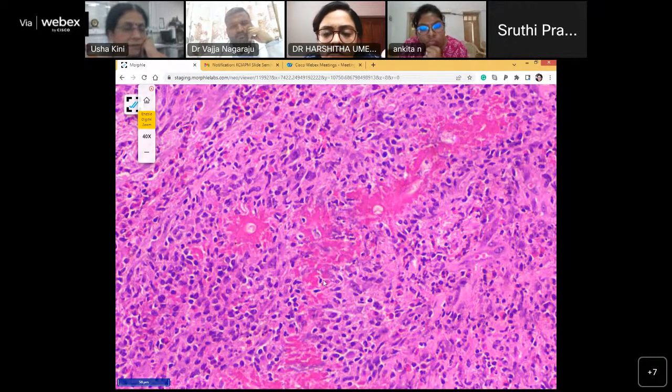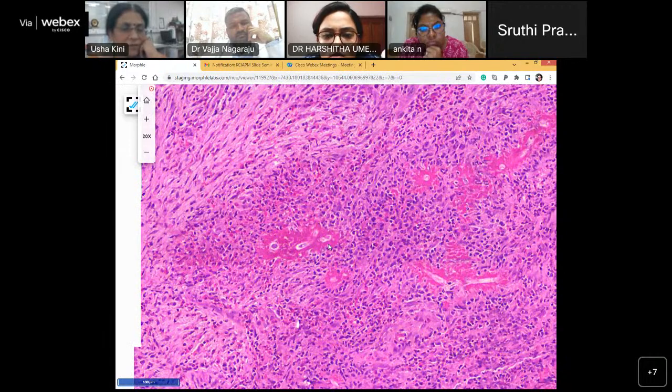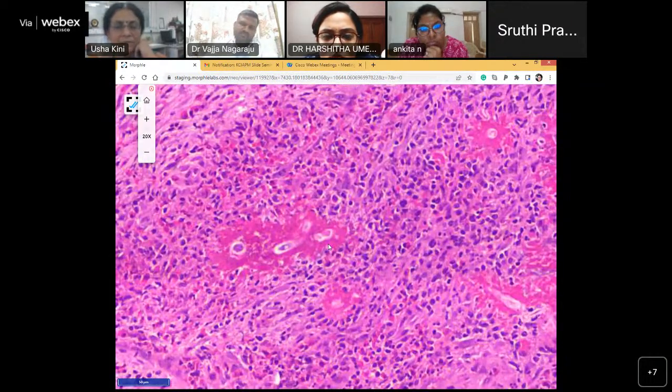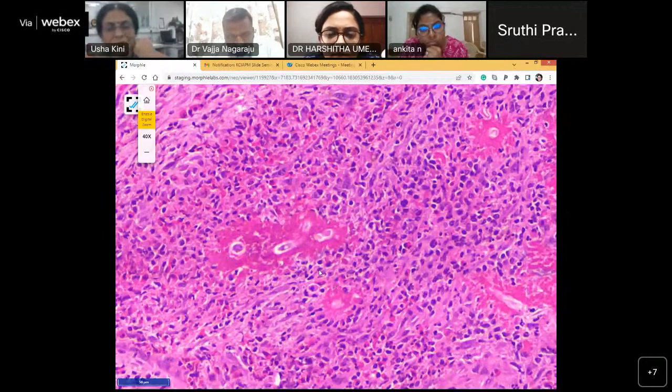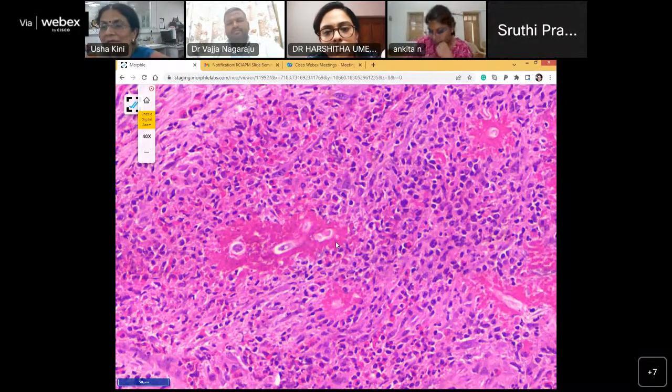Okay, and here if you go closer, you see there is something in its center which has a morphology which is quite distinct. I think I am at the max. So what someone was saying, yes, this is something from outside. This looks like hyphae and they are in the center, but it is inducing a very strong Splendore-Hoeppli phenomenon. Okay, so wherever you see that, you see this.